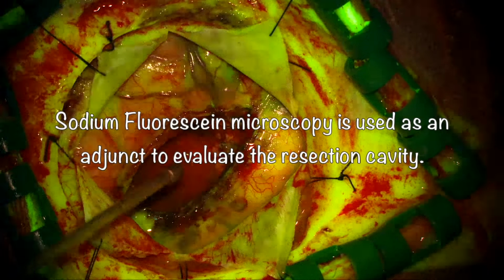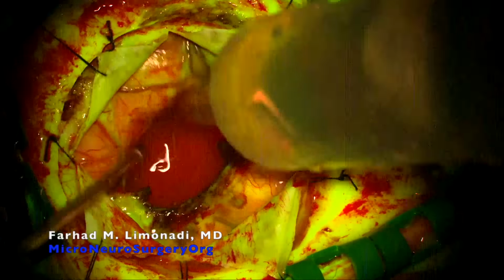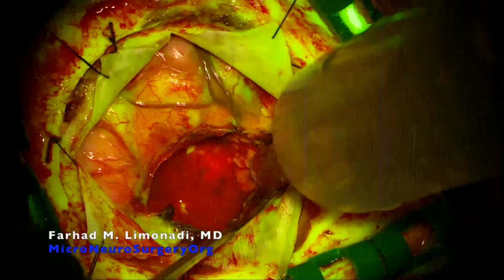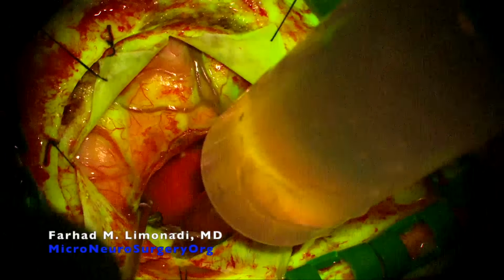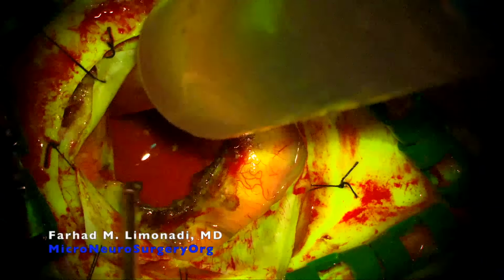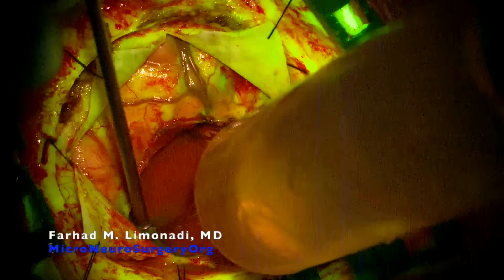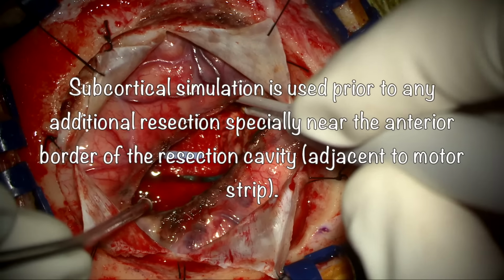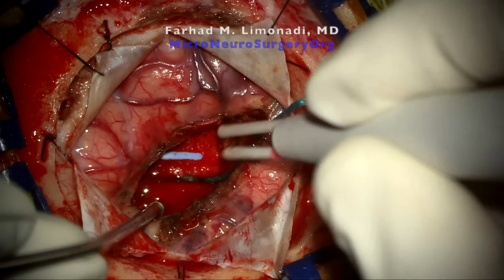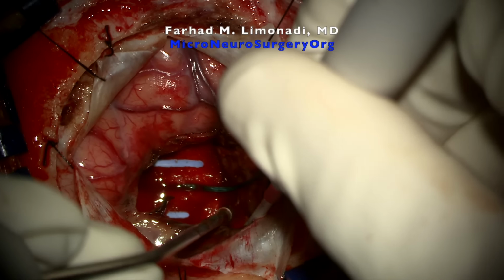Sodium fluorescein microscopy is used as an adjunct to evaluate the resection cavity. Subcortical stimulation is used prior to any additional resection, especially in the anterior border of the resection cavity adjacent to the motor strip.